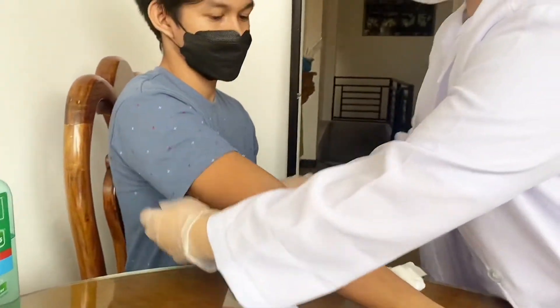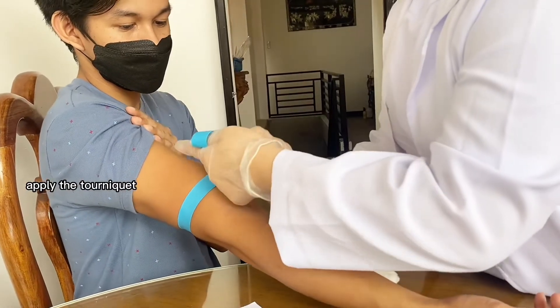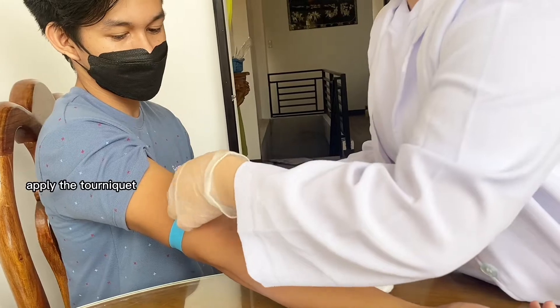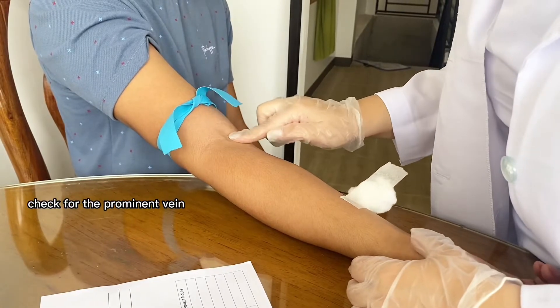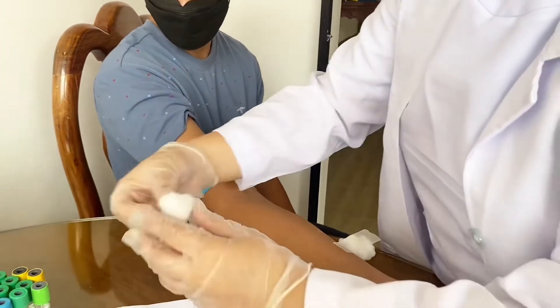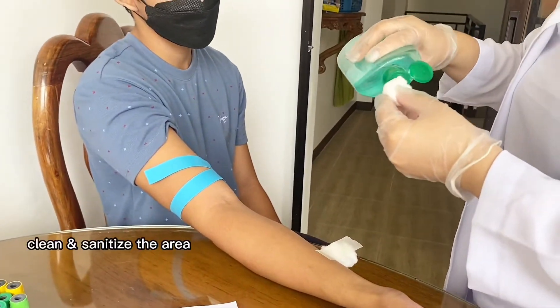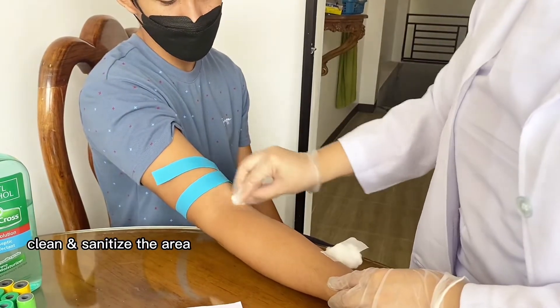For the venipuncture procedure, firstly, you have to apply the tourniquet. And then anchor and check for the vein. After identifying the vein, clean the site with a 70% alcohol swab for 30 seconds and allow it to dry completely. Clean the site in a round motion.